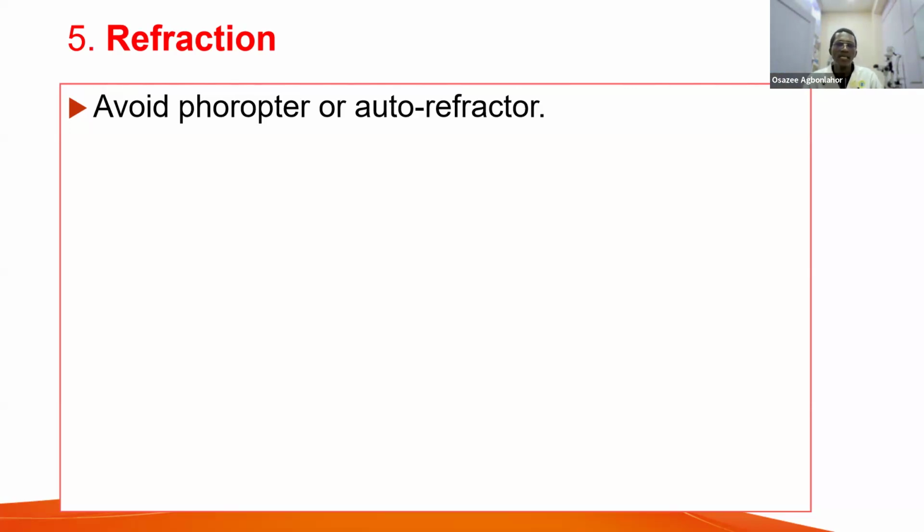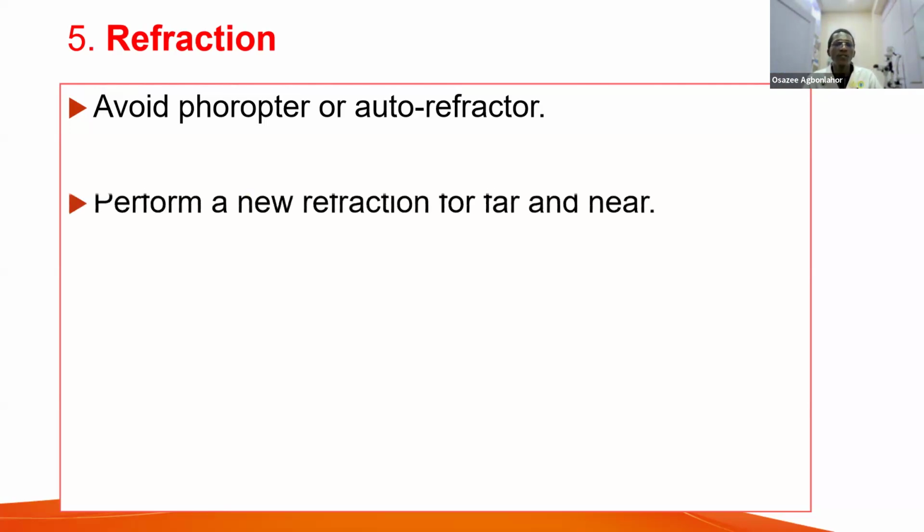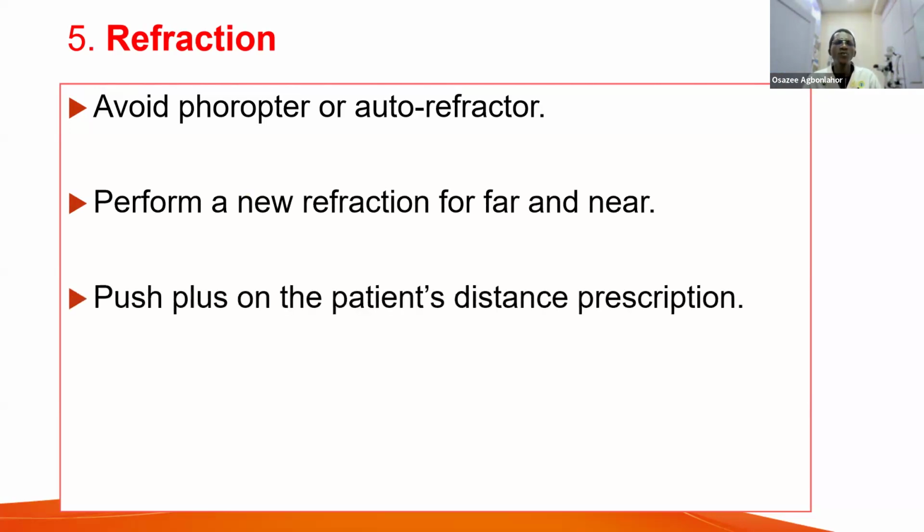So I always advise that you stay away from the autorefractometer when you are doing contact lens fitting, and also the phoropter. Perform new refraction for far and near. So do your refraction over again. Push plus lenses for the patient's distance prescription.